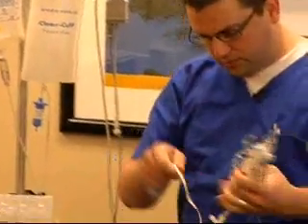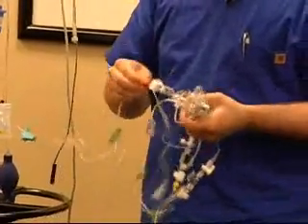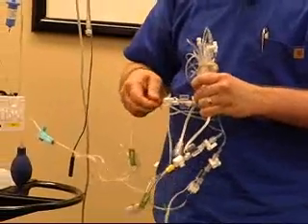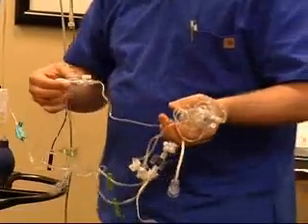Also, if you remember, when you take these out of the package, a lot of times these connections are loose. So just go through and do a real quick little check on your connections and make sure that they're not really loose. Tighten them up. It also is set up for what you might call a progressive prime.